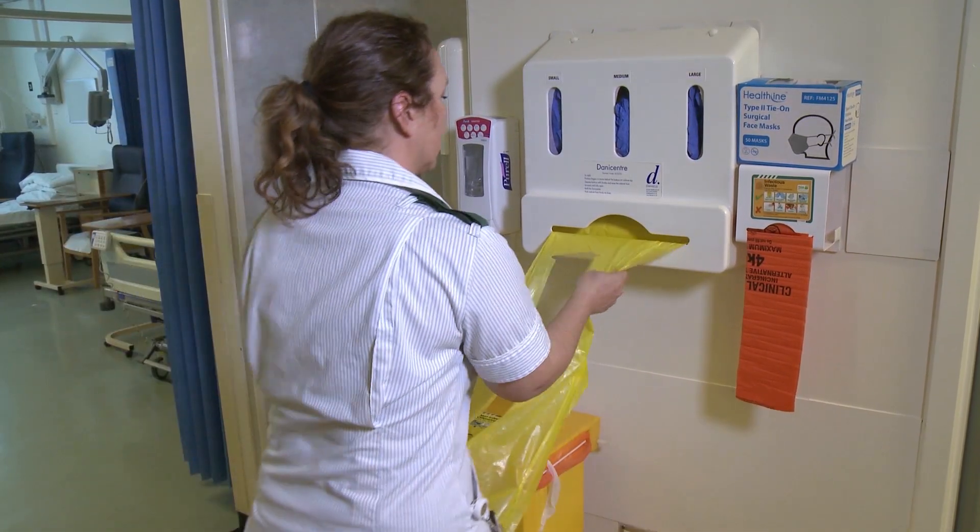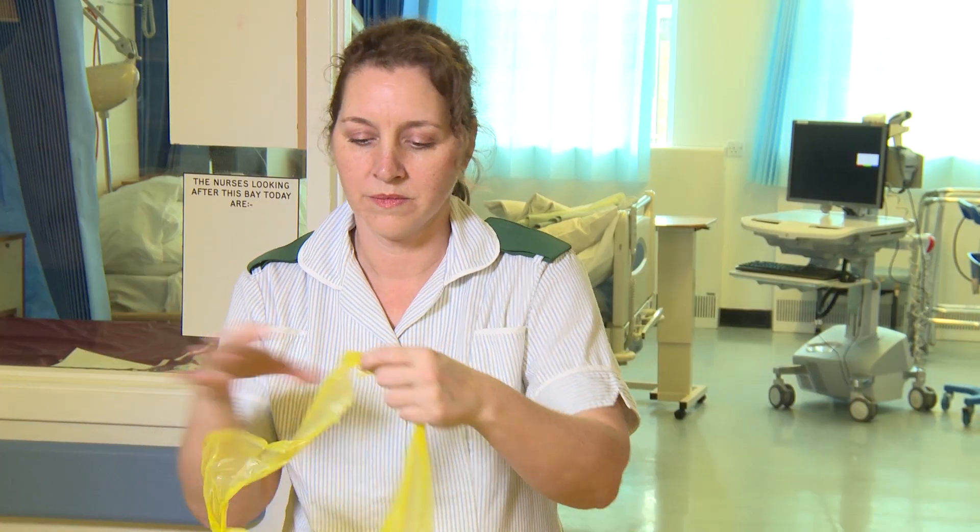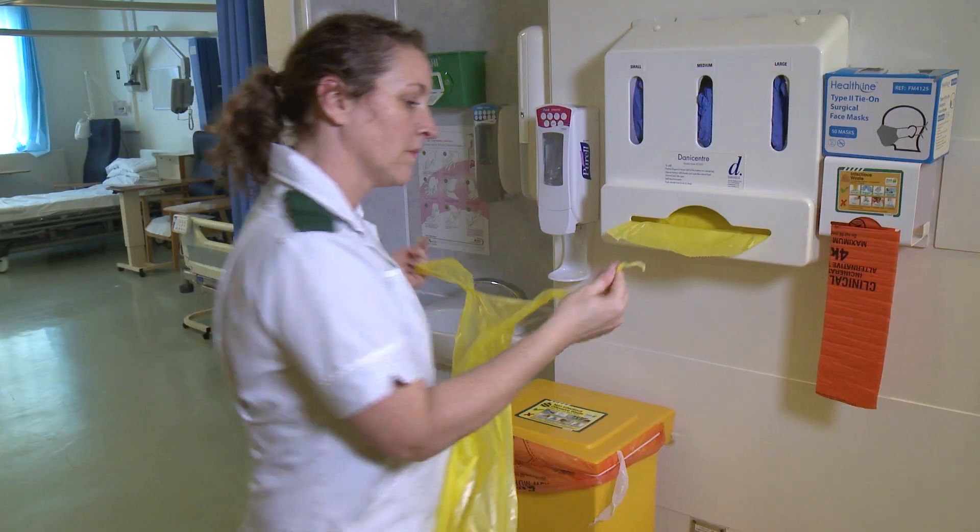Don plastic apron. Snapping the neck loop in half enables the neck to be fully covered.